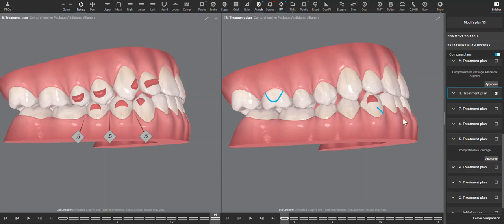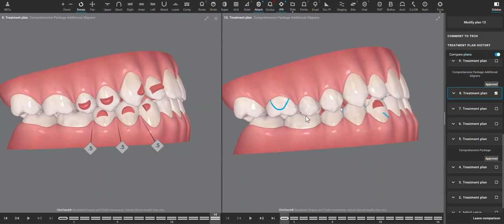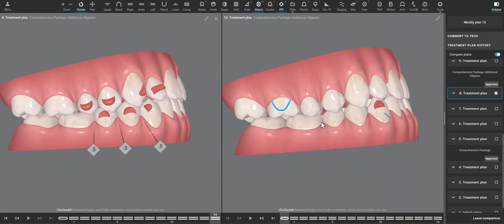using elastics can help encourage the lower anterior teeth to retract, but it's not going to be correcting this Class 3.